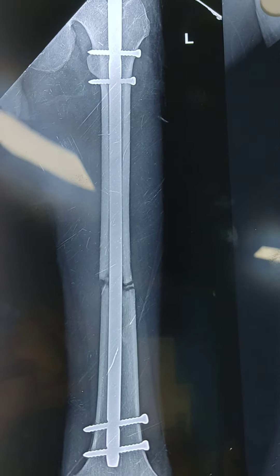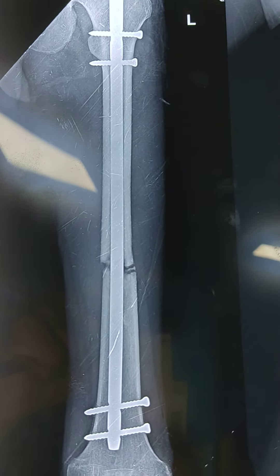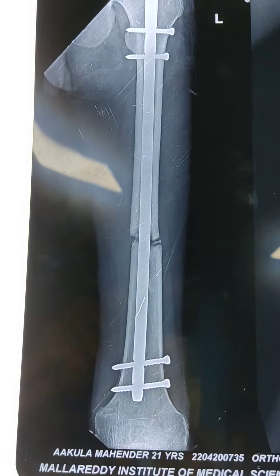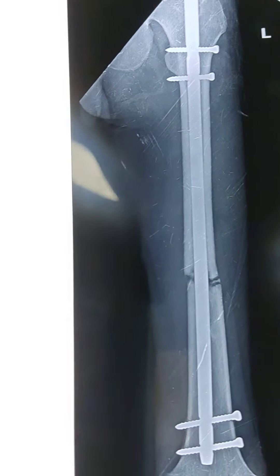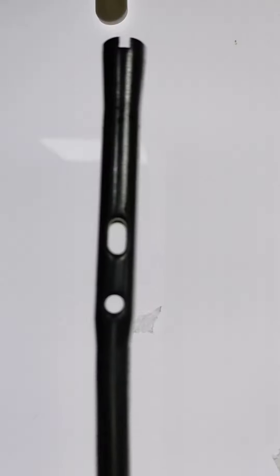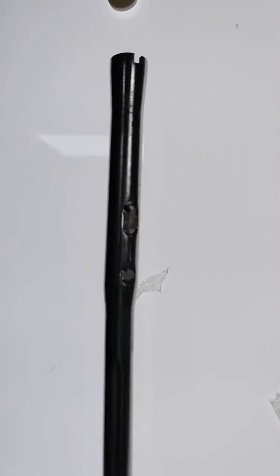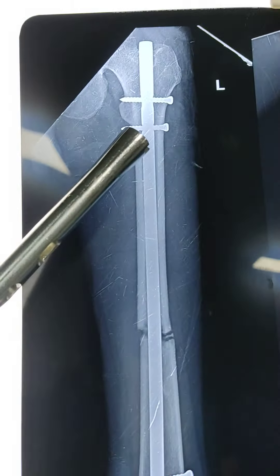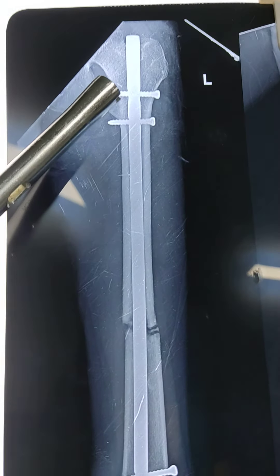You can see proximally there are 2 screws and distally there are 2 screws. At this juncture we can attempt doing dynamization. This is the normal nail — these are the proximal 2 screws and these are the 2 distal screws. This is the static hole and this is the dynamic hole.